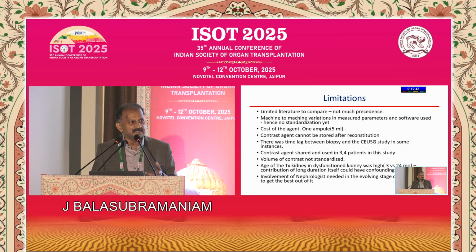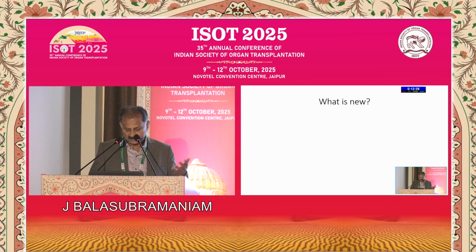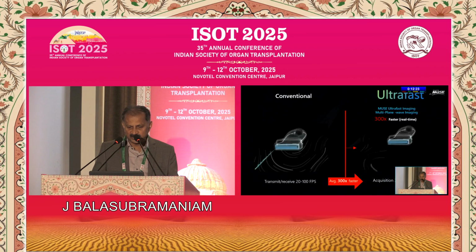But to make it cheaper, I had to club cases. So some of them there was a significant time gap. So all these were limitations in the study. But larger centers with more volume, I think they could do much more. And something new has been happening now. What is new?